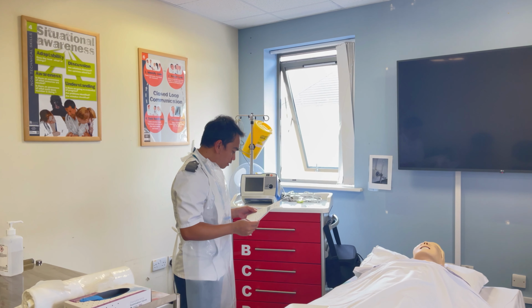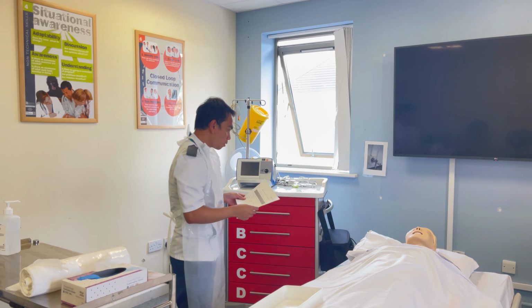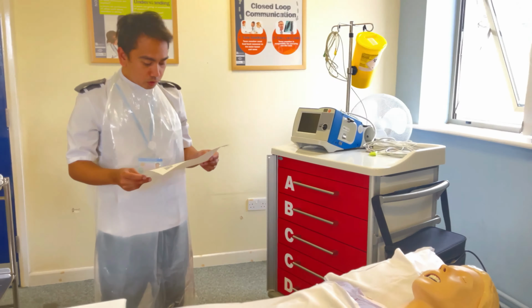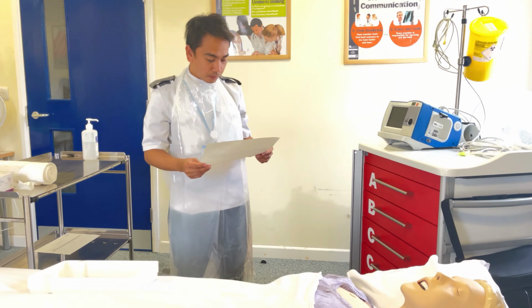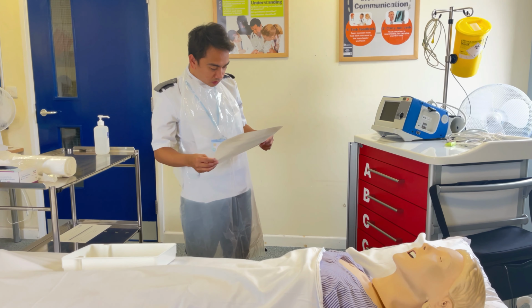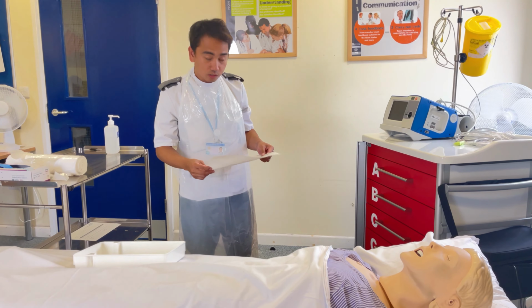Hello, good afternoon. How are you? My name is Ruel. That's what I told you a while ago. I'll be your nurse for today. What I told you a while ago, we will be doing a VIP flush. That is just to make sure that your cannula is patent. Are you still all right for me to proceed? Yes. All right then. Before that, I just need to expose the area of your cannula, if that's fine.